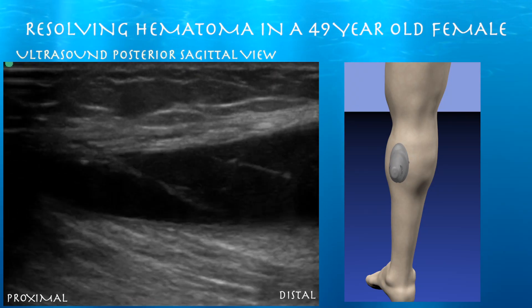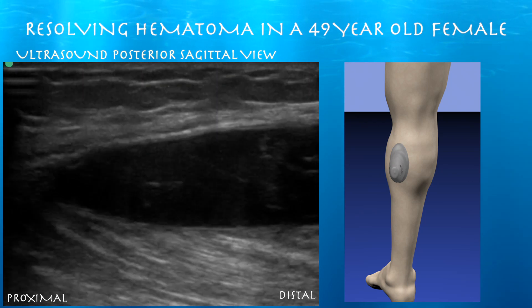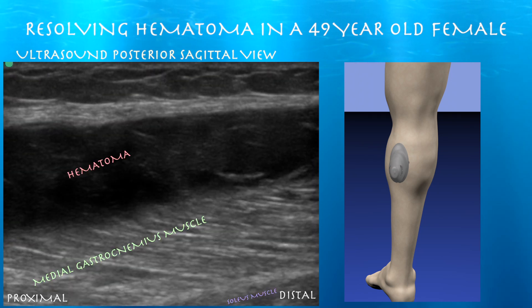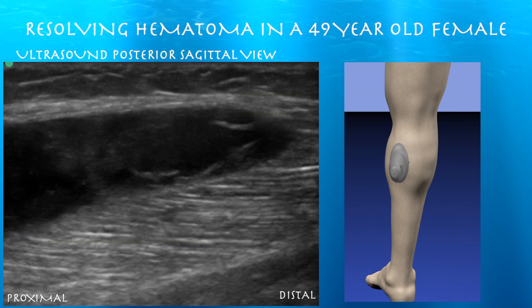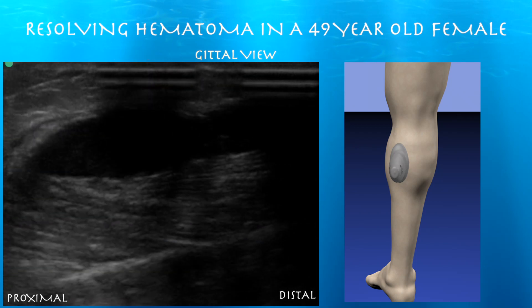Here we are looking at this very large mass again within the medial gastrocnemius muscle. The right side of the screen is distal. We have a computerized model showing the position of the probe during the procedure. Here you can see this very large hematoma at the superficial aspect of the medial gastrocnemius muscle, and we're just trying to find the distal and proximal extent of it.